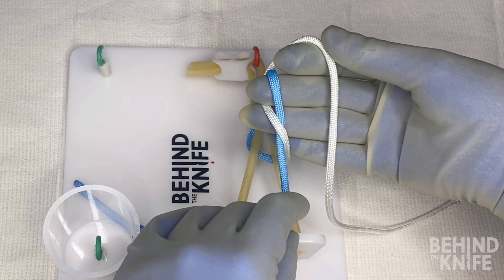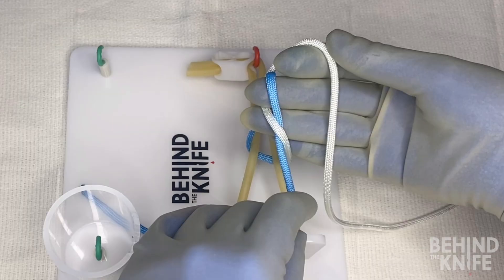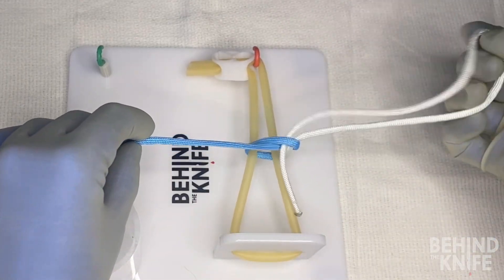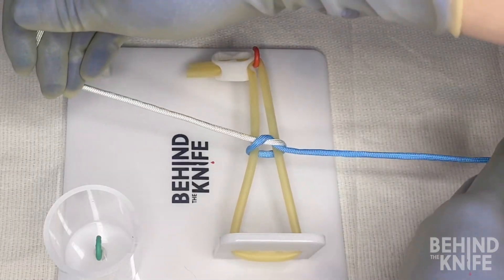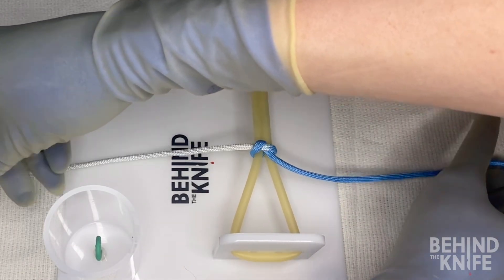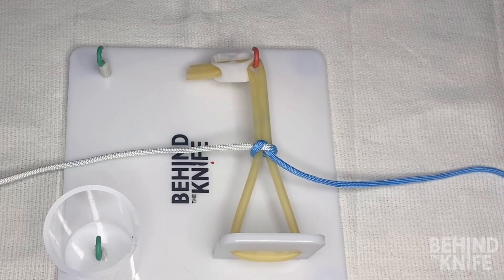Then with my middle finger and ring finger pinched, I'm going to pull the white end of my string through and cross my arms to lay down a square knot. Now this is just one half of our knot. In order to continue throwing square knots we'll have to switch to making fours, and I'll show you what that looks like.